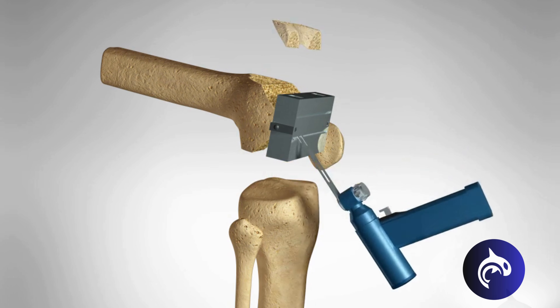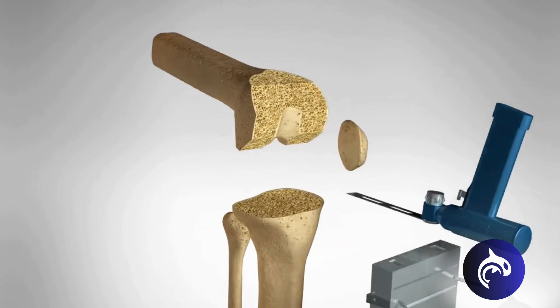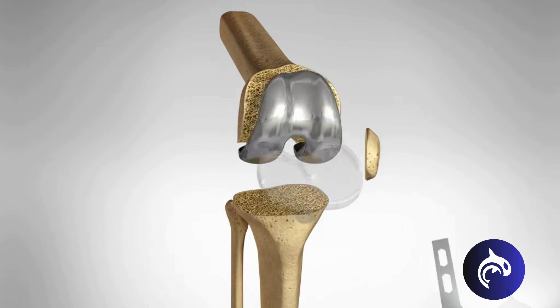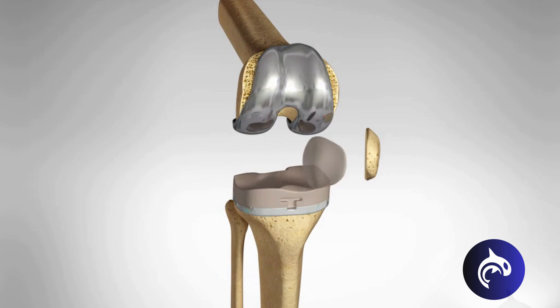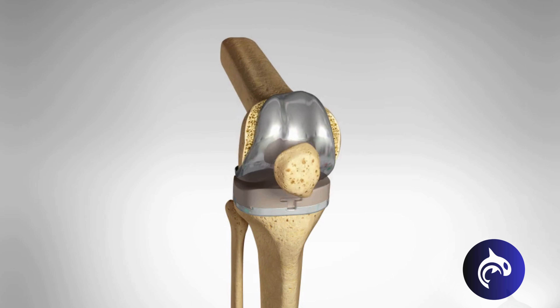Next, the tibia is prepared with special guides and the undersurface of the patella or kneecap is cut. Metal components will be implanted to recreate the surface of the joint. A medical grade plastic spacer is inserted and the patella resurfaced with a plastic button to create a smooth gliding surface.